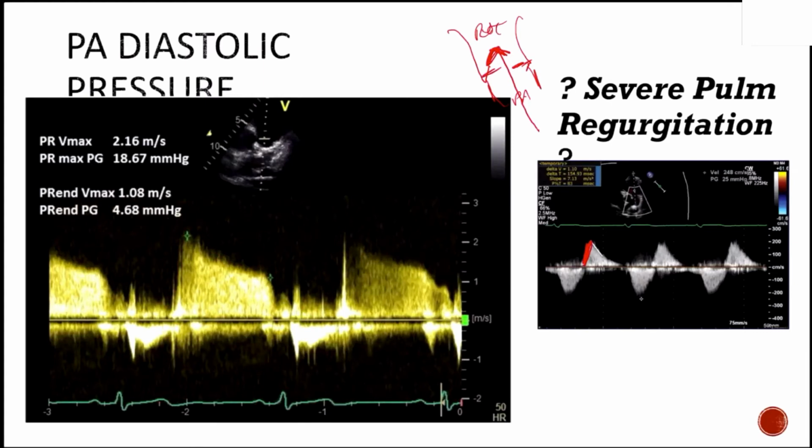All that blood flow goes very quickly, and then the blood flow stops, right? Because the two chambers are the same. The blood flow is not going down a path of least resistance anymore because it's the same. It's a closed circuit. So this here, which is nice and slow, is as the chambers are starting to equilibrate, and here is much faster. So your blood flow basically cuts off. And so we can actually underestimate our PA diastolic pressure in very severe pulmonary regurgitation because we can't even measure where this area is because the chamber's equilibrated so quickly. Does that make sense? All right, cool.